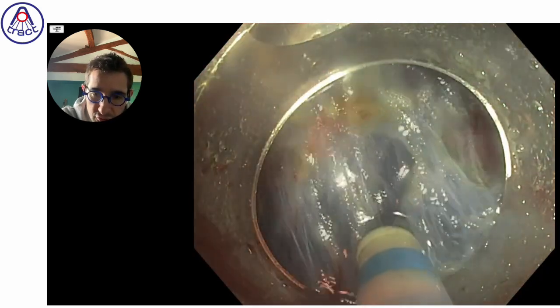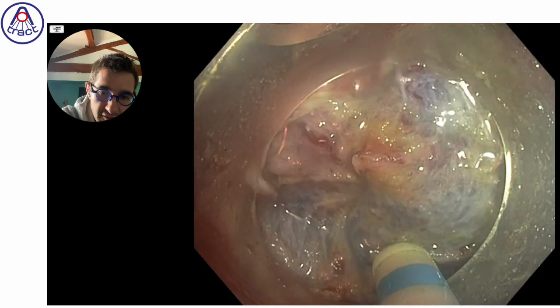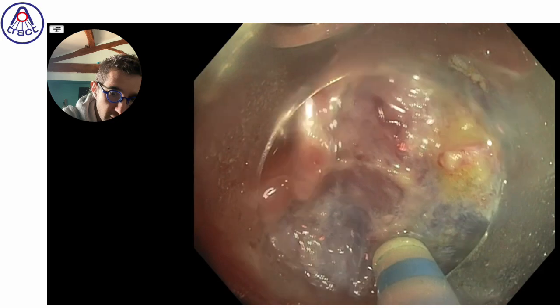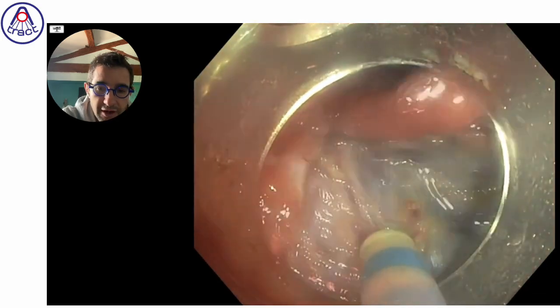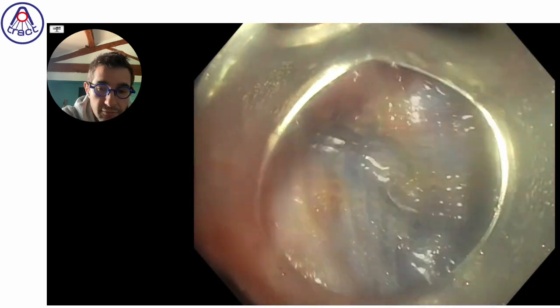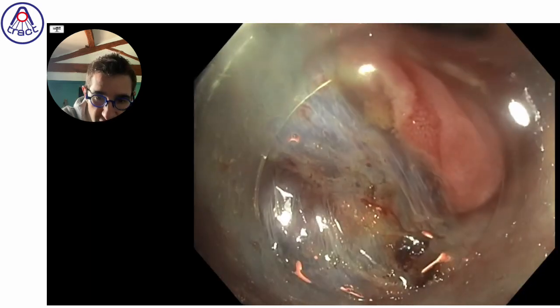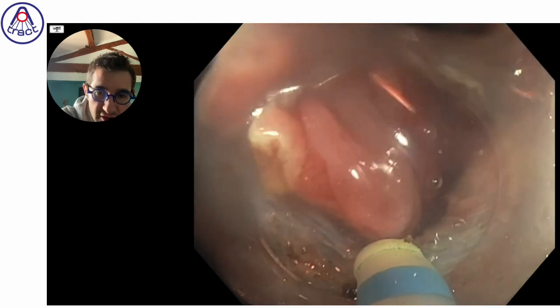So at least to reduce cost, to reduce environmental burden of our cases, trying to reduce the number of devices and doing hemostasis with the knife itself is almost always possible by trying to be more precise and to really detect the bleeding point thanks to good exposure, cap exposure, RDI, washing, etc.